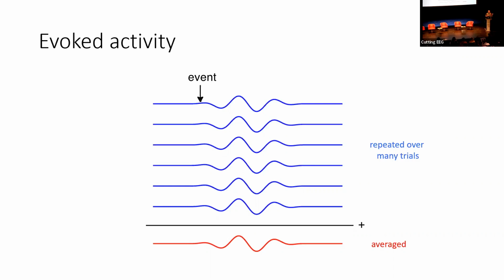If you have a constant stream of images, which is a video, of course, the brain is constantly responding to these. What you can think of is that you have the stimulus and you have the response. If you have many stimuli after each other, you can basically add all of these responses to all of these stimuli.